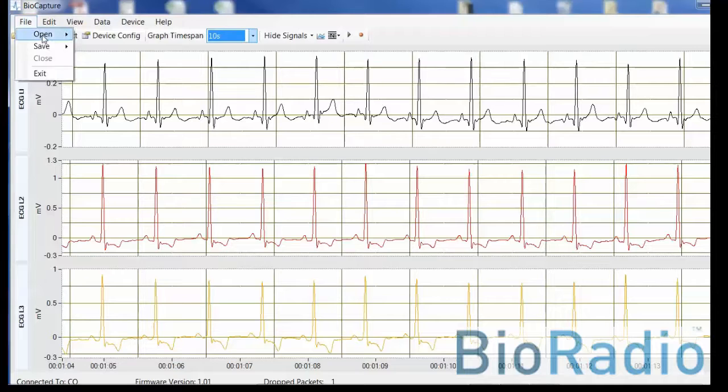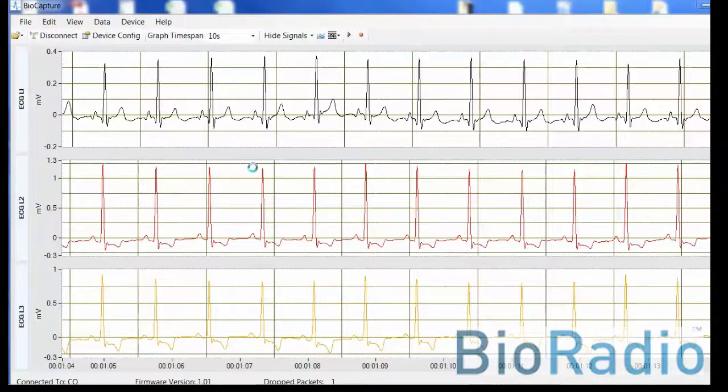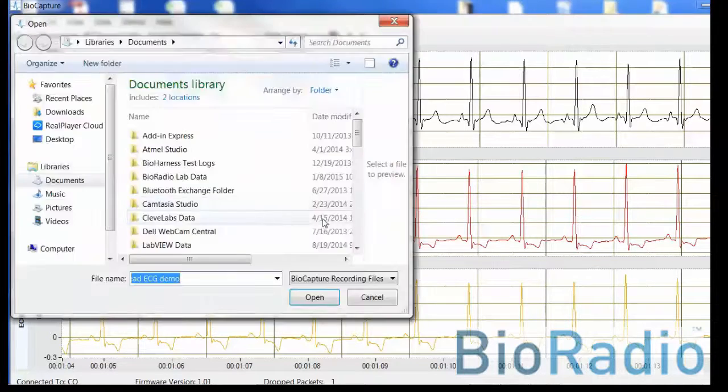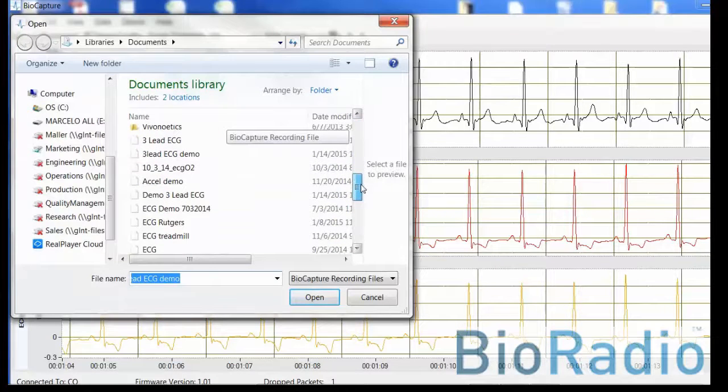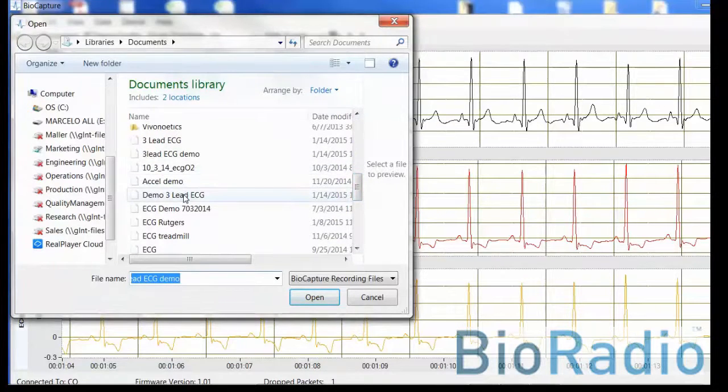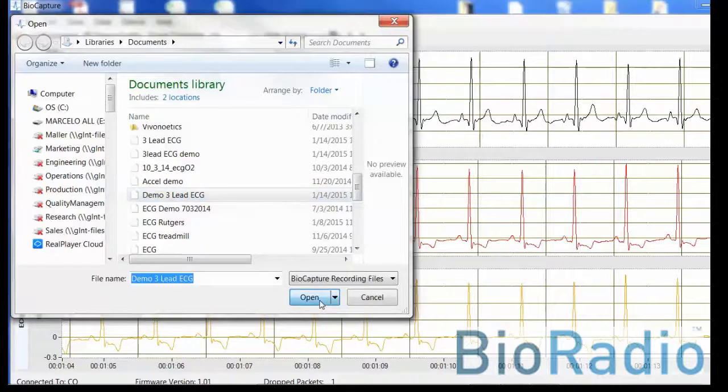To look at recorded data, select file. Select recordings. Locate the name of your folder, name of your file. Open the file.